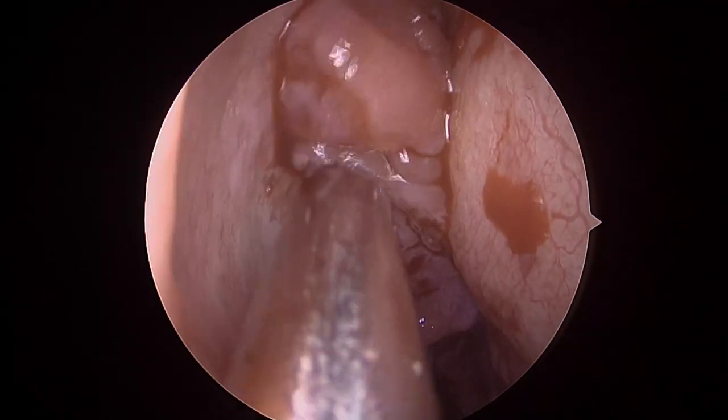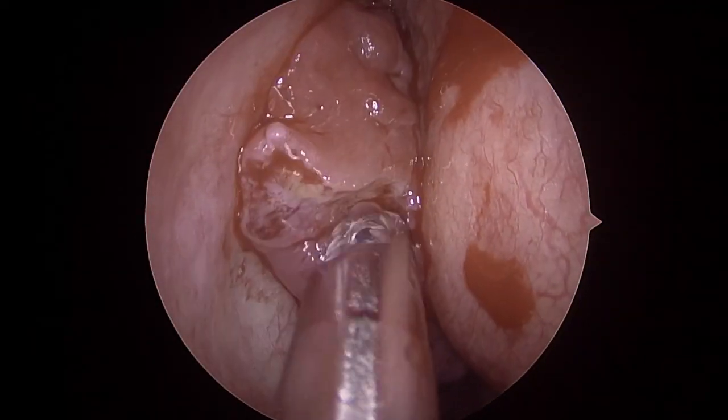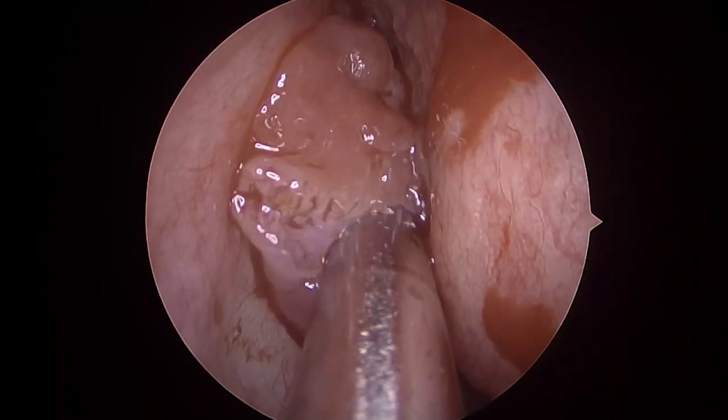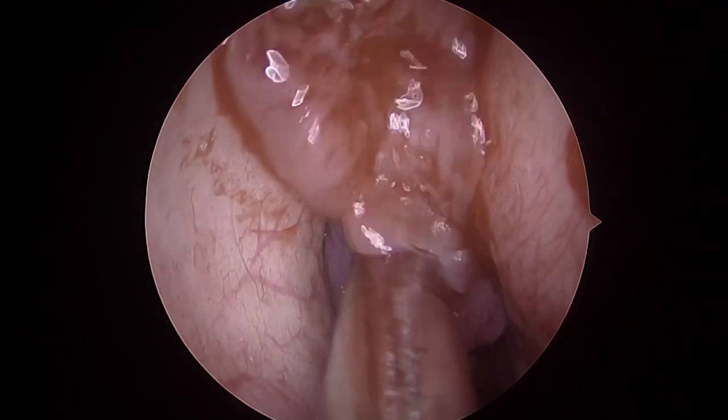The important point here is you should allow the tissue to be sucked into the debrider and then start cutting. The cutting edge of the microdebrider should always be in view, and you should ensure that you're not debriding the septum or the lateral nasal wall accidentally.